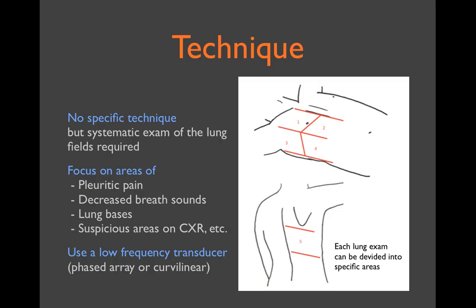There's no specific technique to scanning for pneumonia. One simply scans through the intercostal spaces between the ribs to look for the signs we're going to demonstrate. However, a careful and systematic approach to scanning the large surface area of the thorax must be employed in the absence of localizing data.